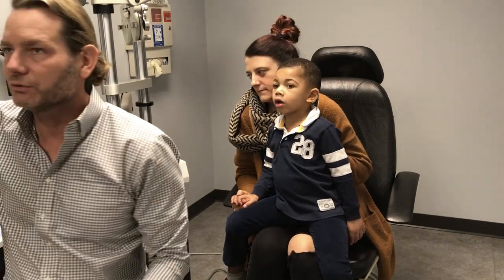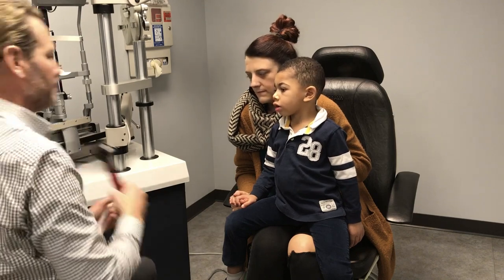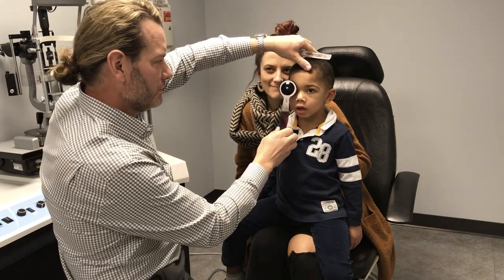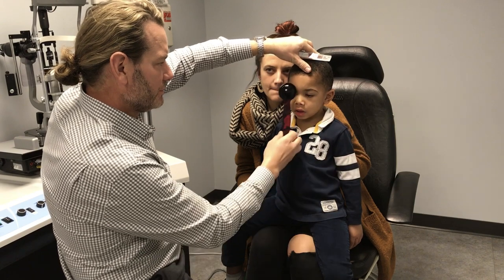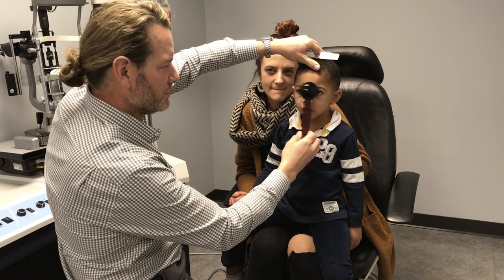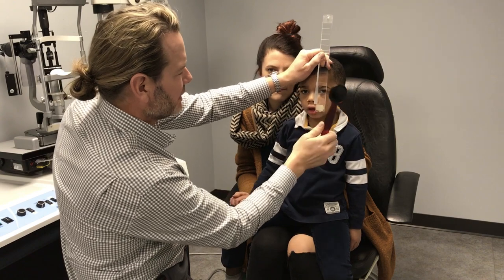let's have a single letter or picture, yeah. All right, now we're going to look way down there. Do you see that picture? What's that picture? Yeah? Look at it. Is it a horse? Yeah. Watch the horse. Do you see the horsey up here? You still see it? Good job. Where's the horsey?